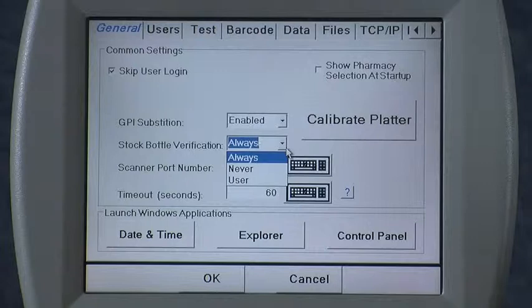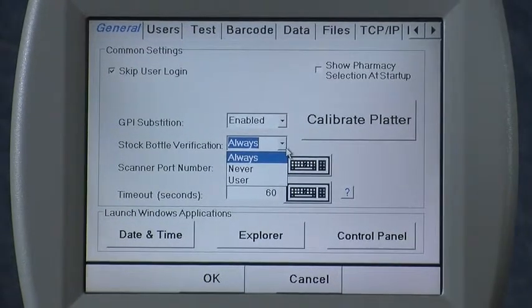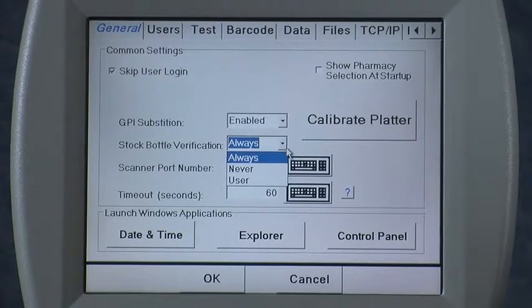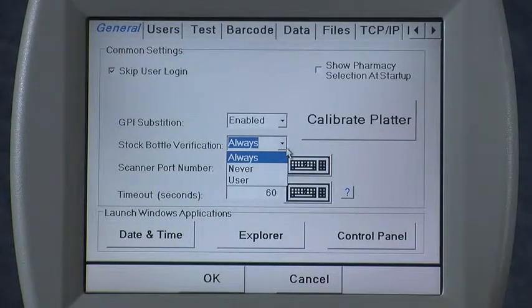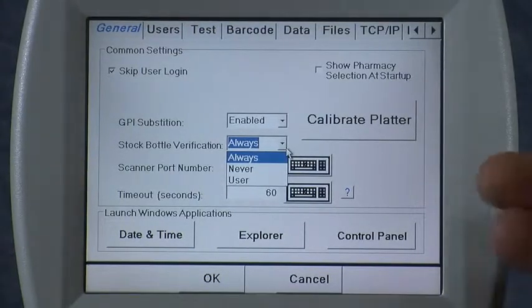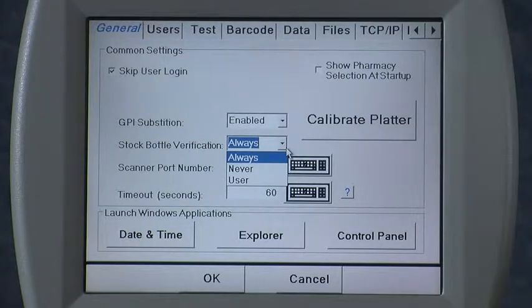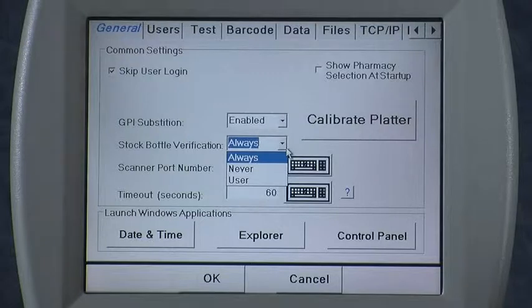Stock always indicates that after you scan a prescription label telling you which stock bottle to use to fill the prescription, 'Always' will force you to always scan the stock bottle to validate you're filling the right drug. 'Never' means it will skip over that step all the time, and 'User' means it will apply another button onto the menu that says 'Skip Validation,' which allows you to avoid the validation process sometimes but go through it the rest of the time.